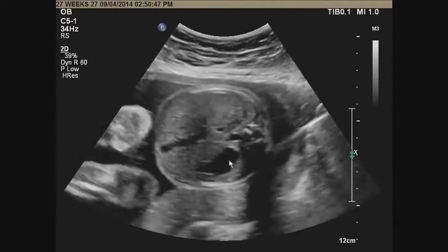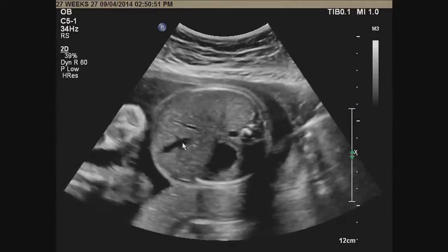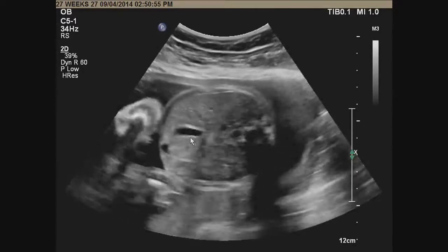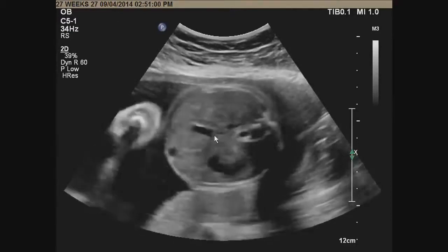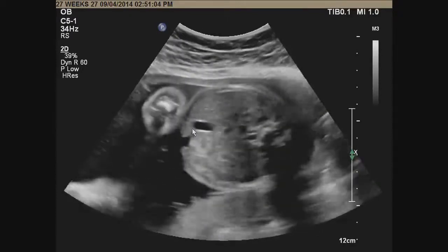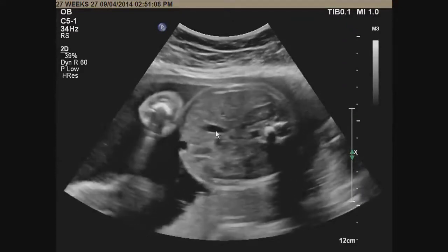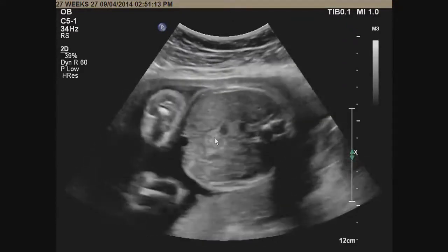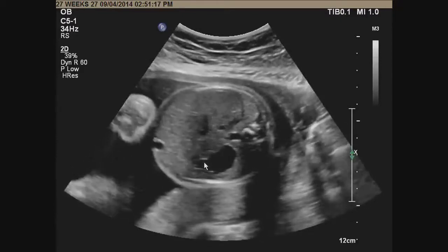As I look at the abdominal situs, I see the umbilical vein coming in. I see the venous system in the liver, but I also always look to see the gallbladder in the fetus. And I want to see the gallbladder on the right side of the abdomen. This is important when you're dealing with heterotaxy, to make sure you're not dealing with problems related to the biliary system in the fetus, because that certainly changes the prognosis substantially. So I have a normal situs in the fetus.